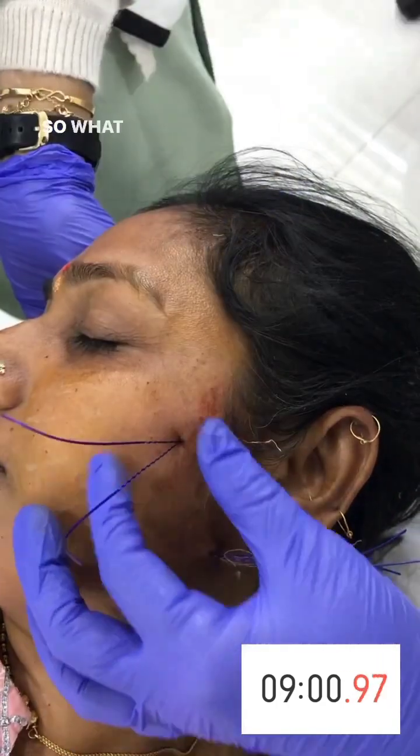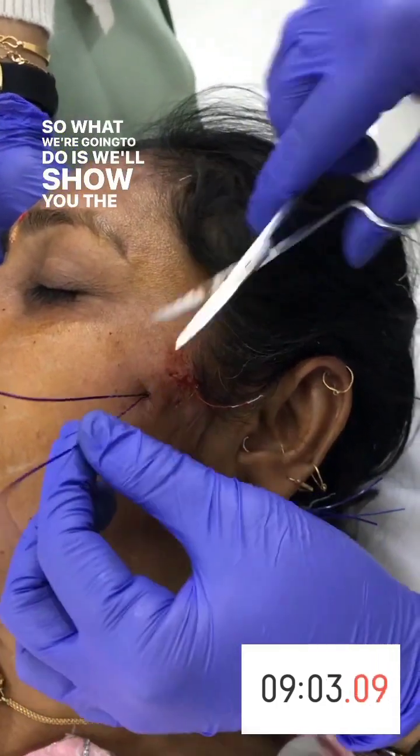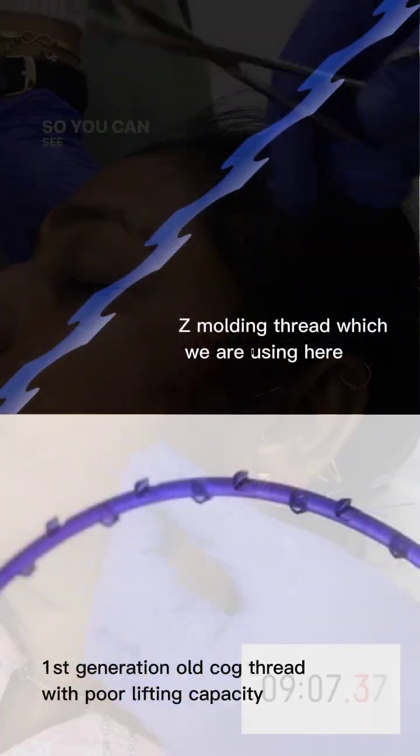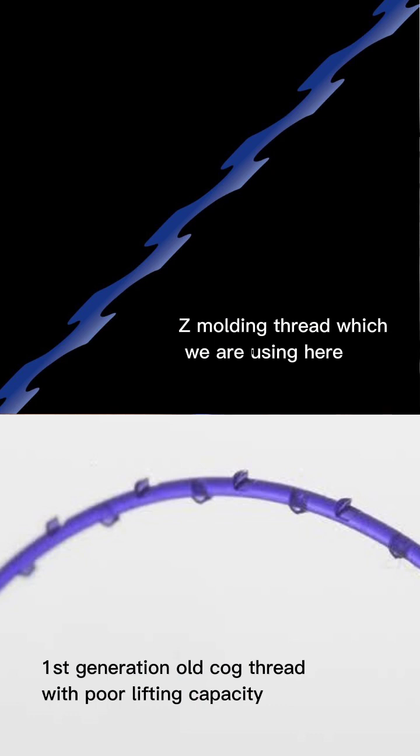We're going to show you the magnified version of this thread. You can see those threads contain all these cones and flat versions, which get very effectively anchored to the tissue underneath.